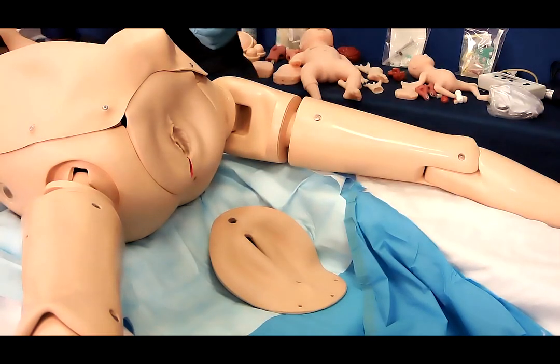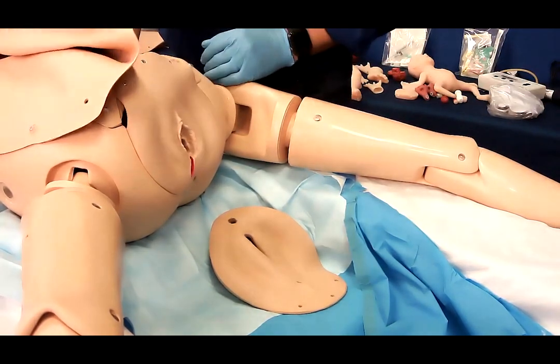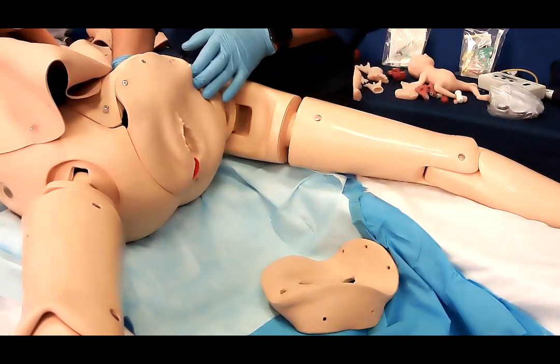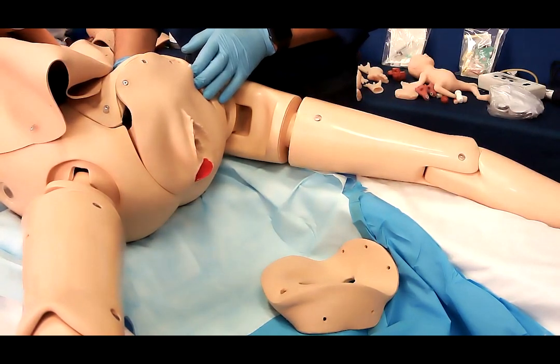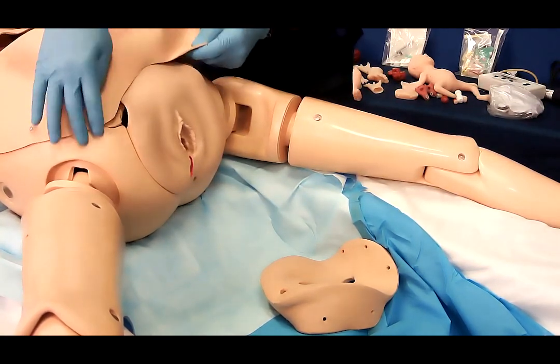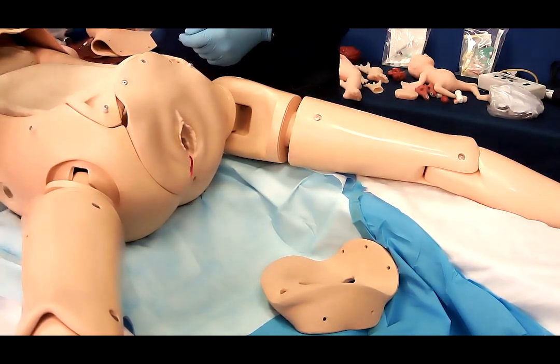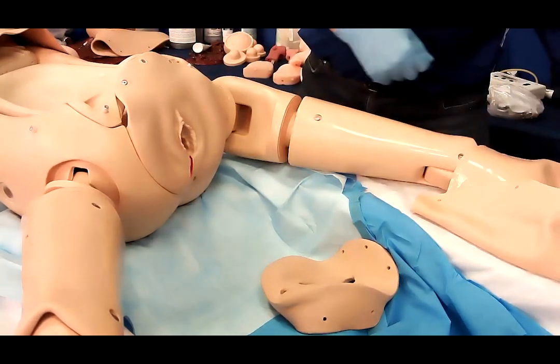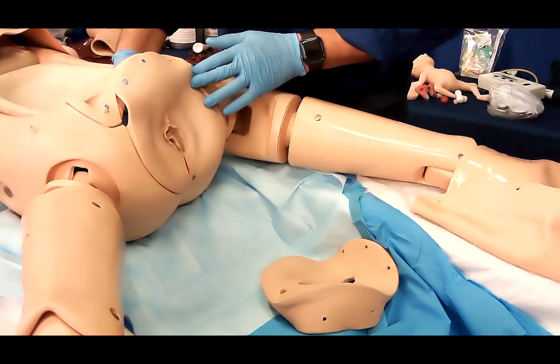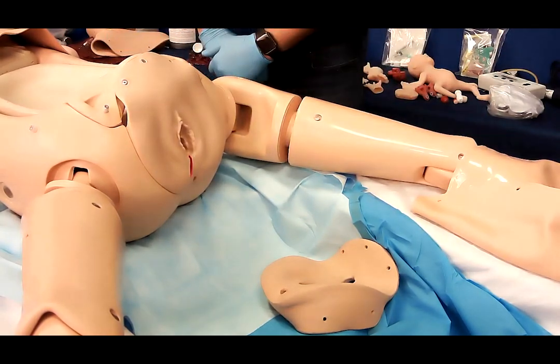For postpartum care, episiotomy, replace the perineal birthing skin with the episiotomy skin. Place the pelvic block into the torso and install the perineal skin foam stabilizer pad. The skin will withstand several suture opportunities. The sutures may be left in place for nursing practice. To extend the life of the skin, use a small needle and avoid pulling the sutures too tight. Simulated blood may be added for greater realism.